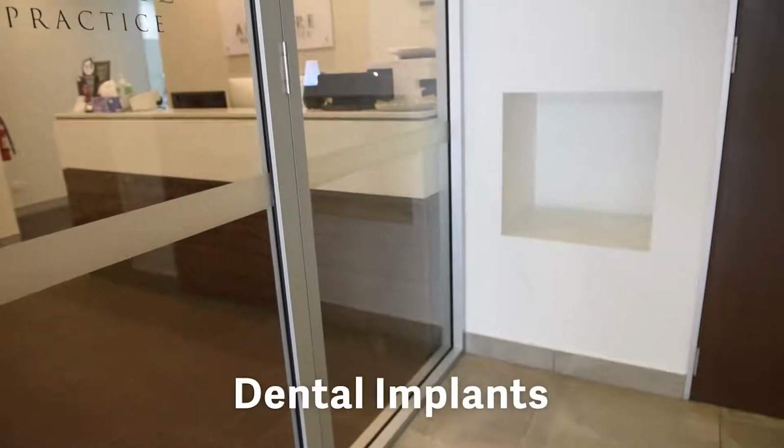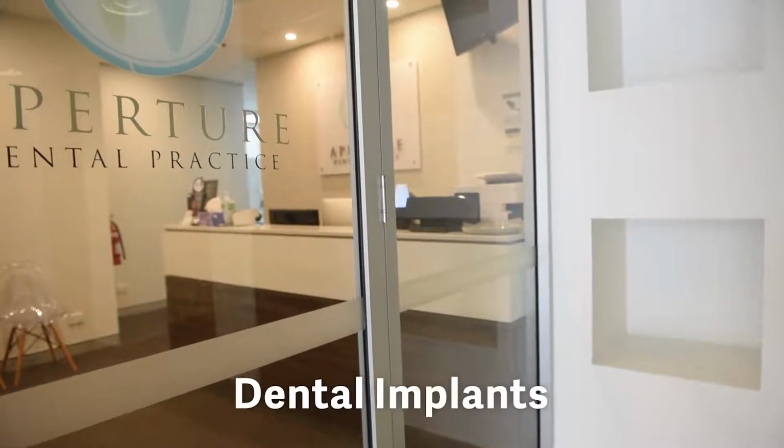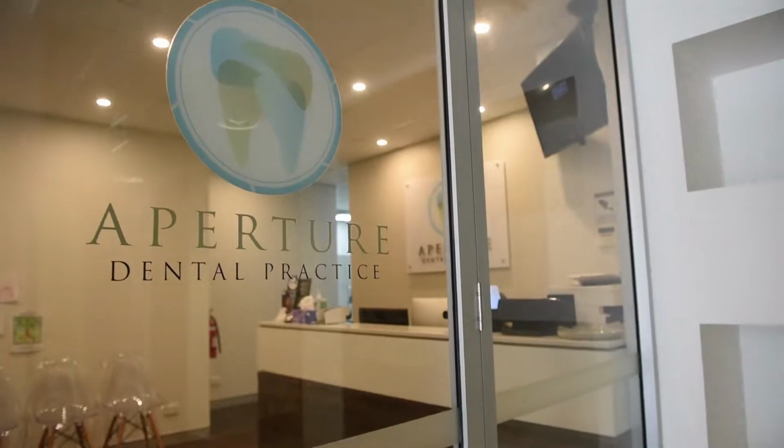A dental implant is like a screw, and this screw is screwed into your jawbone. Once it is in your jawbone, it sits in very tightly. And once it is integrated or healed into the jawbone, then you can put in a tooth that goes onto the implant, something like this.